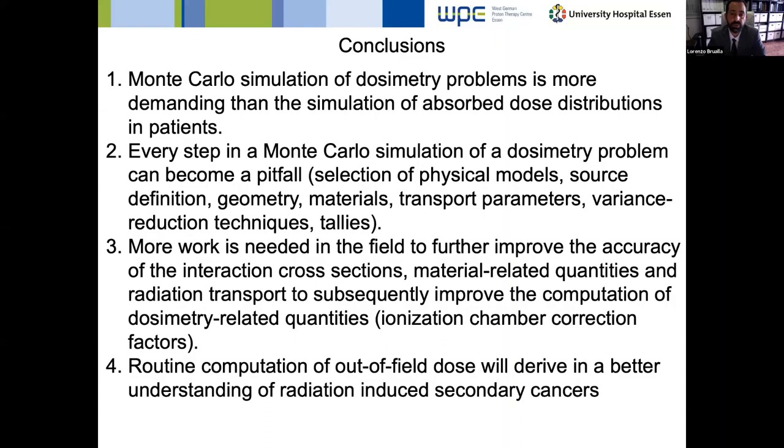Okay, thank you. How do you see GPU as a solution for fast Monte Carlo simulation so that this can be used for routine treatment planning? This is coming from Sachin Dev. This is an issue. Some quite knowledgeable groups, I'm thinking for instance of the group of Steve Jiang in California, have been recurrently trying to implement it. The problem with Monte Carlo simulation of radiation transport is that ideally what you would like to do in a GPU is to distribute one primary particle per processor. So that if you have 500 processors, then you have 500 primary particles being simulated all at once.